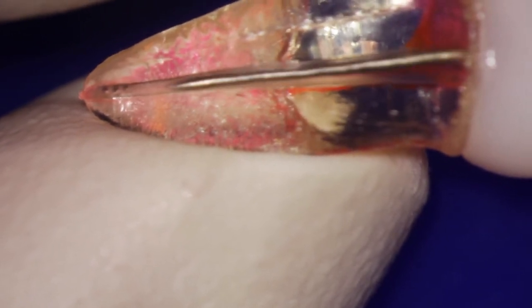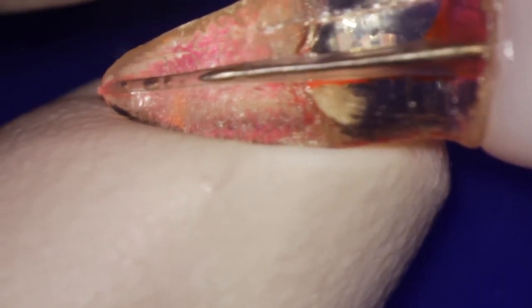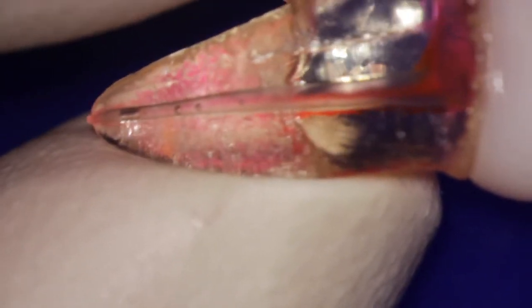Where greater bubbles arise, whether they are caused by cavitation or by bringing in too much air while inserting the files, these regions are not going to be cleaned properly, because neither cavitation nor acoustic streaming will be delivered there. So moving the ultrasonic tip up and down is mandatory to destroy these stationary air bubbles, although changing the fluid frequently also helps a lot.